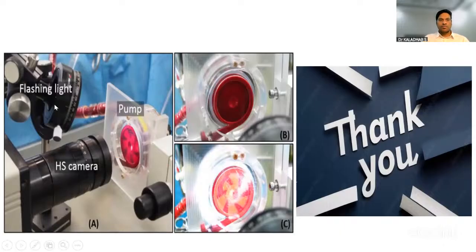And yeah, coming to the end of my presentation. So this is one stroboscope. They look at this impeller, the pump, to see what is happening exactly, so even microthrombi, whatever small thrombus, can be picked up depending upon these pictures. This is also being tried. I did not come across it at any time, but have been studying about this.